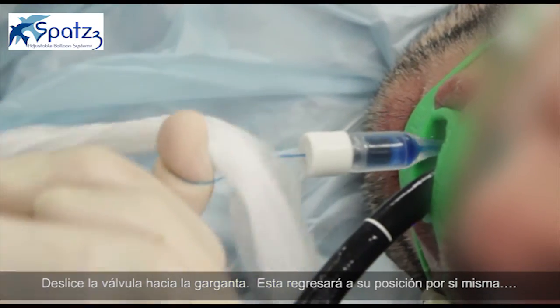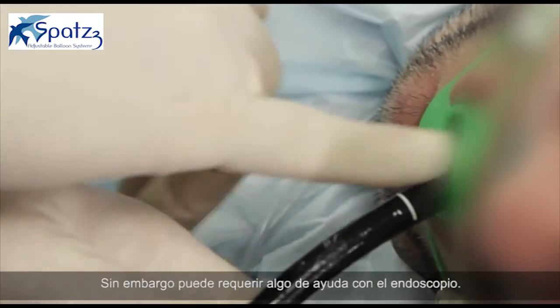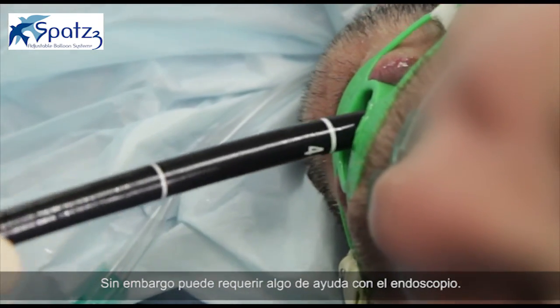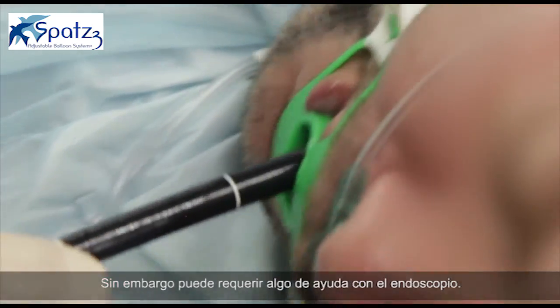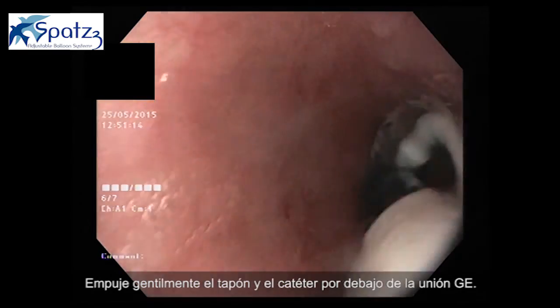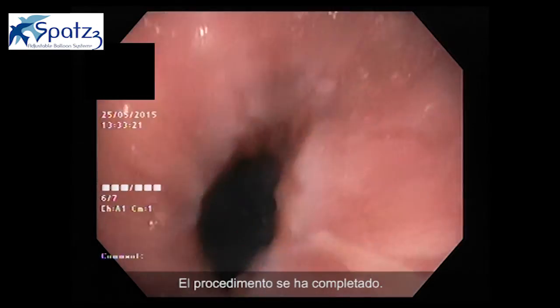Lower the valve into the back of the throat. It will pull itself back to its position, but may require some scope movement to help. Gently push the cap and catheter below the GE junction. The procedure is now complete.